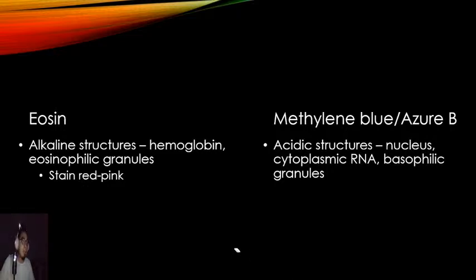Okay? So, guys, when you make a smear and you've counted a lot of basophilic structures, not just basophils, and you see a lot of basophilic structures there, ask yourself the question, did I do the procedure properly? Because I would have probably stained it with methylene blue for a long time. I dipped it more than the required amount of time. Okay? So, tandaan nyo yun.